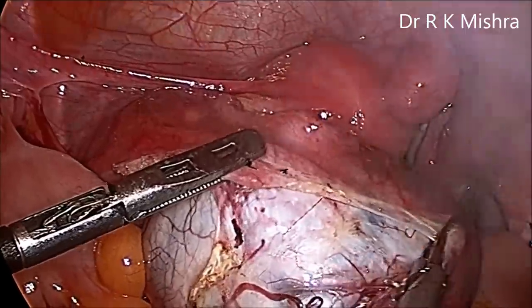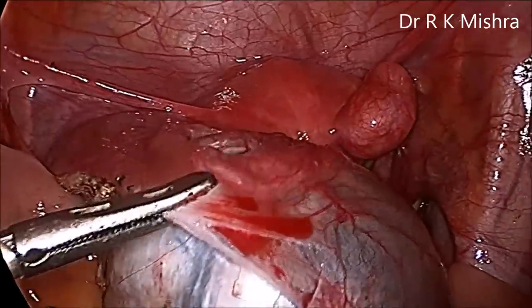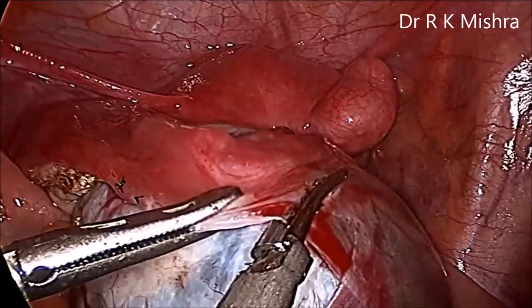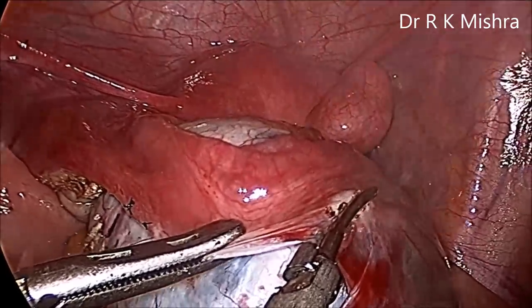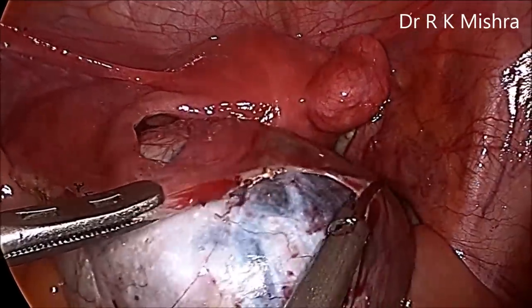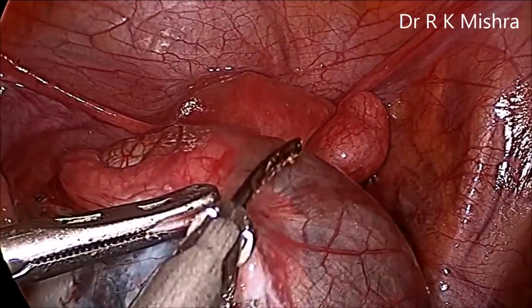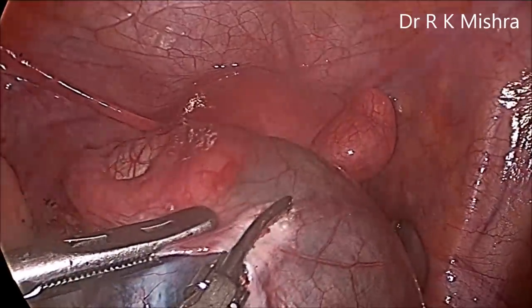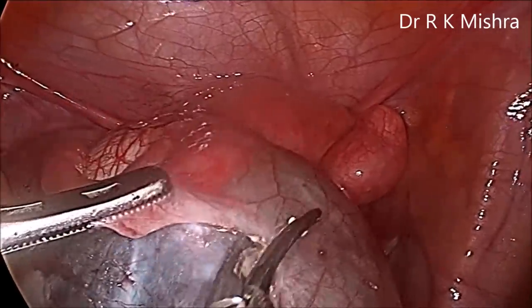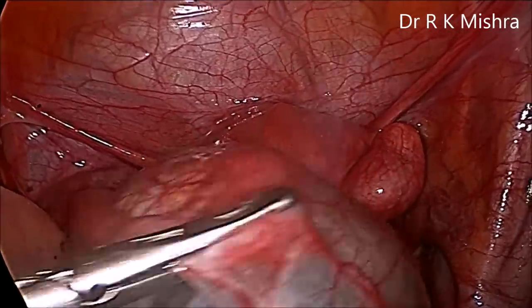During dissection, the silicone jaw of the harmonic should be kept towards the cyst. Otherwise the steel jaw, if it vibrates and touches the cyst, the cyst can be ruptured. Although rupturing of the cyst during ovarian cystectomy is quite common, if you do copious lavage and suction, there is no complication. Even if it is a dermoid cyst, there is a chance of chemical peritonitis, but that can be easily controlled by repeated lavage and thorough cleaning of all quadrants. Now we are near the fimbrial end of the tube on the left side.